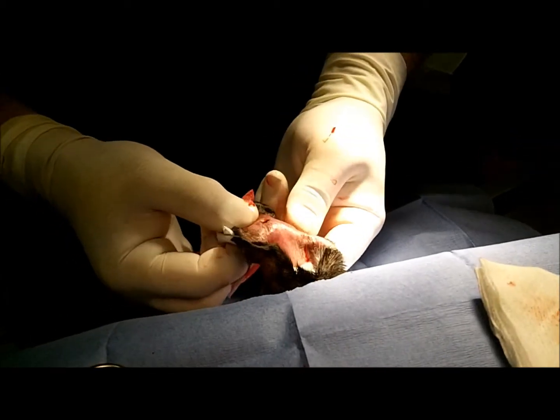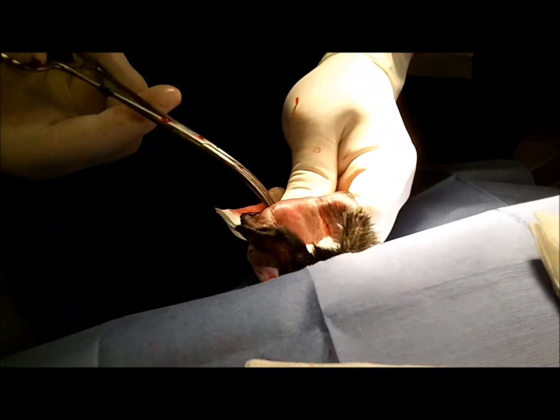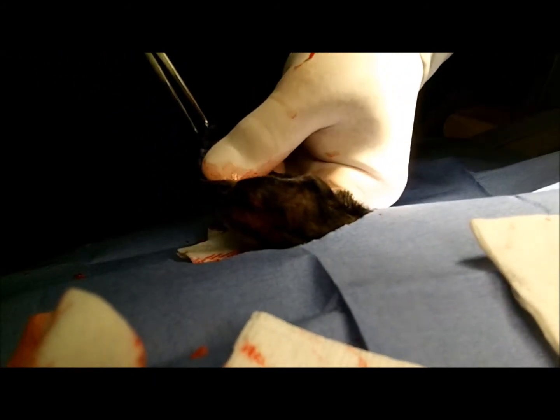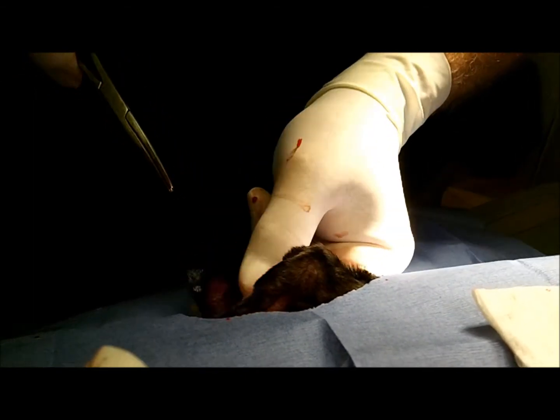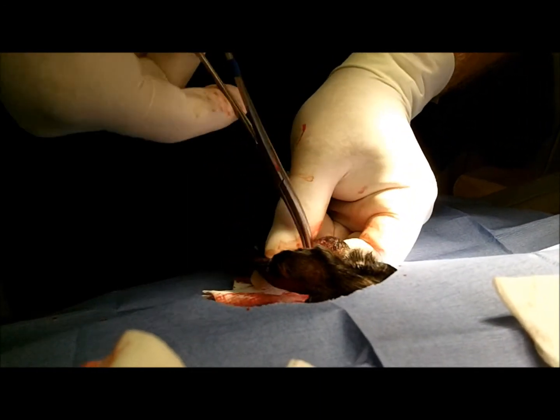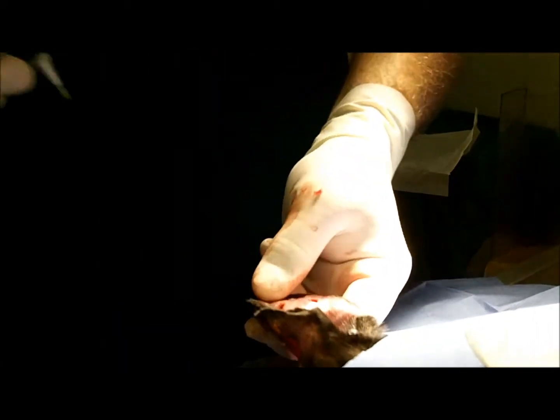We've got most of the debris out, and we're going to get a little bit more out. That's the nice thing about having multiple access ports.